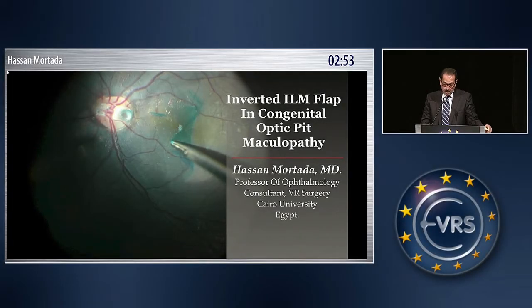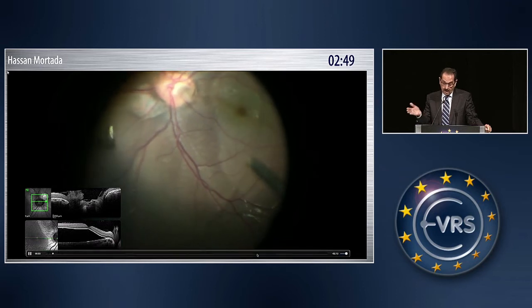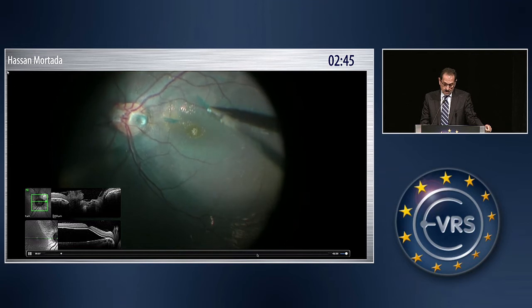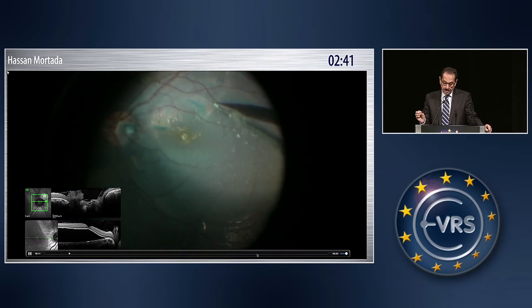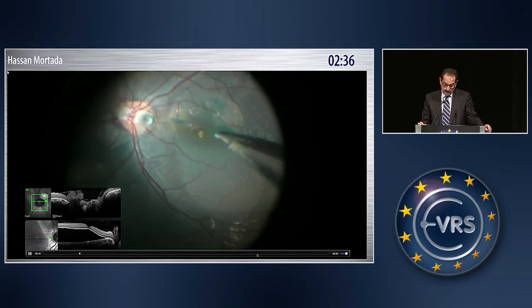I realized long ago that it is not enough to cover the optic nerve pit with the ILM flap. So I started to put the flap, or the ILM, inside the optic pit, maybe one year ago.